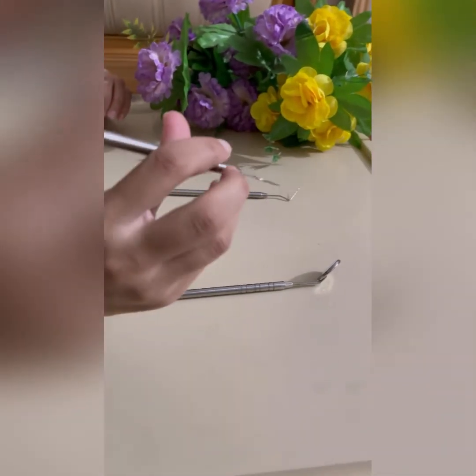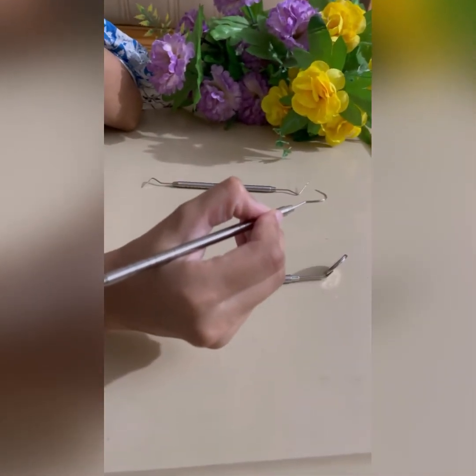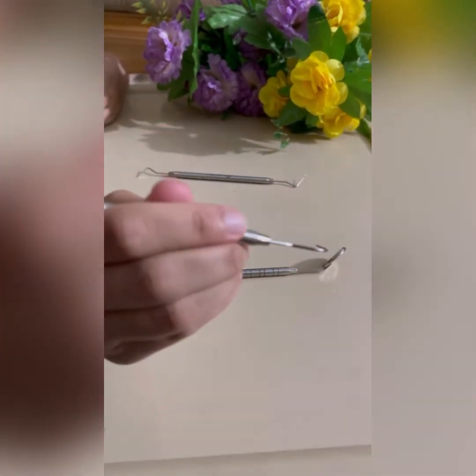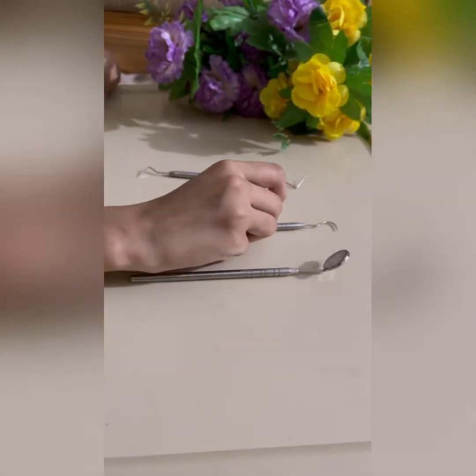This is basically the sickle portion of the explorer. When we apply this portion on the tooth surface, if we are suspicious whether it is decayed or not, and it is smooth, then it means there is no carious tooth. There are only stains present on the tooth.